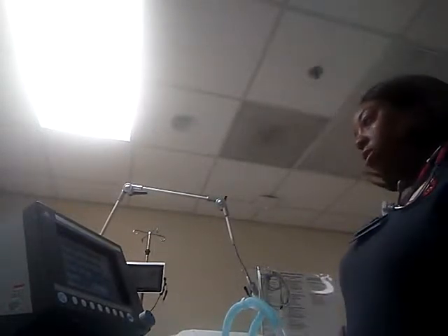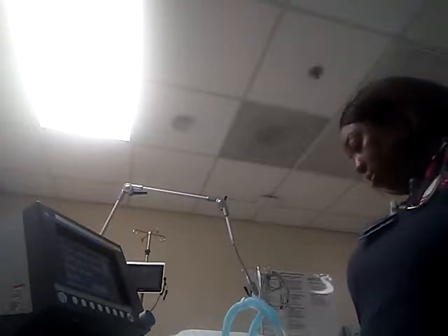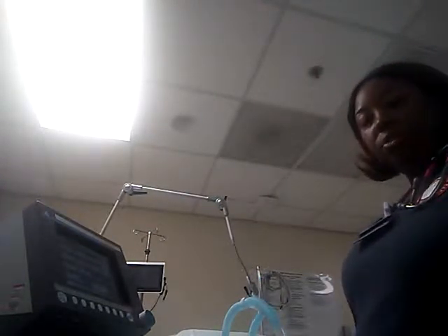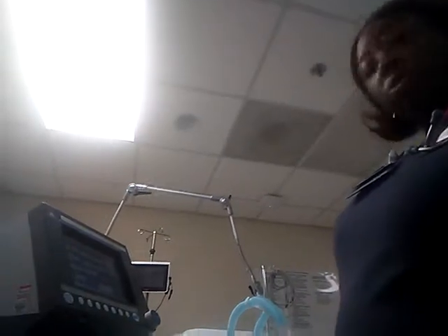We're back and we're changing our event settings. I kind of already changed them, but I'm gonna show you how to change them anyway. So we've gotten our ABG on a patient. The physician gives you your order to change the ventilator settings because they don't need to be on what they're currently on. You do want them to stay on full support mode, but you just want to change the settings.